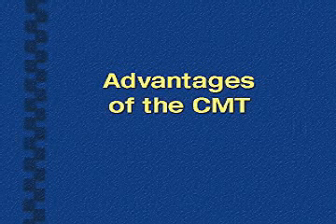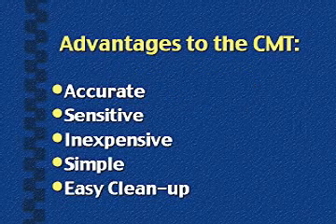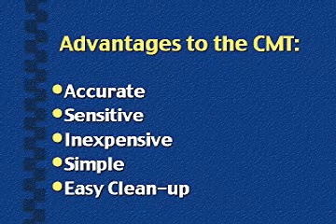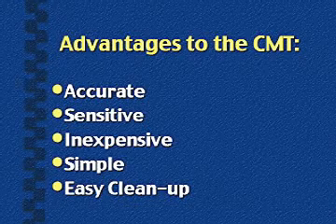There are many advantages to using the CMT. The CMT is fairly accurate in measuring the somatic cell concentration in milk and correlates well with other tests. It is sensitive. It's inexpensive. The test is simple and requires little equipment. The paddle is easy to clean up. Simply rinse with water.